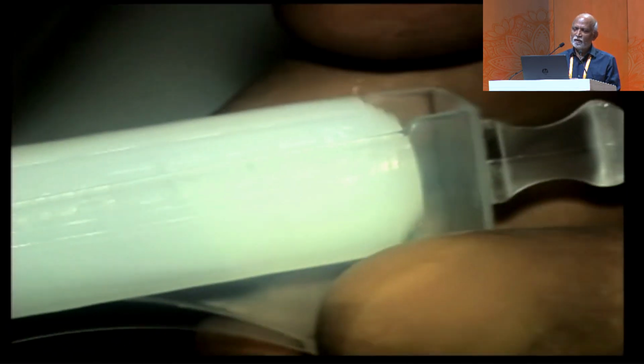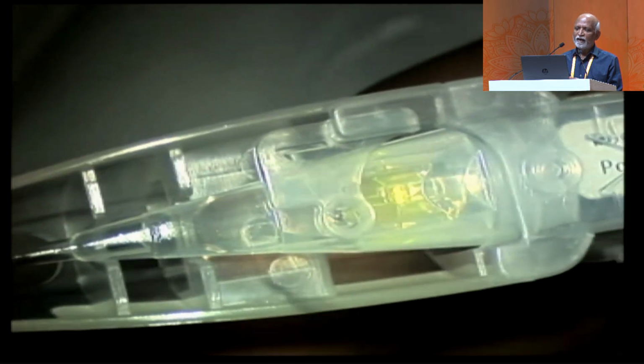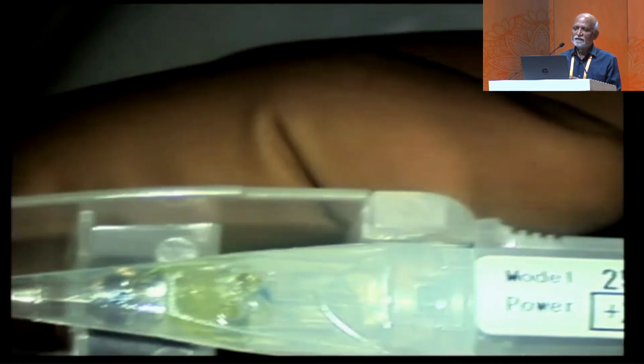This is the Hoya preloaded lens, and you put in the viscoelastic, and when I picked it up from the box and made it vertical, the plunger just fell off.